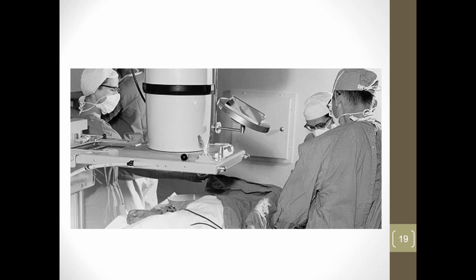They had the C-arm concept fairly early in the development of the technology. One thing that's missing from this is the cameras and some of the other peripheral stuff, but it gives you an idea that the technology has stayed fairly the same. There weren't any real huge advancements for several years after they started to do them.